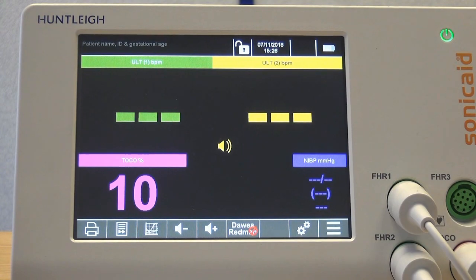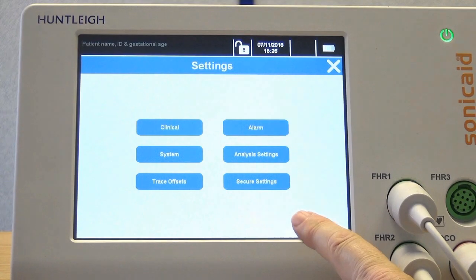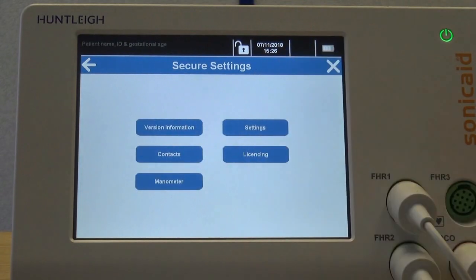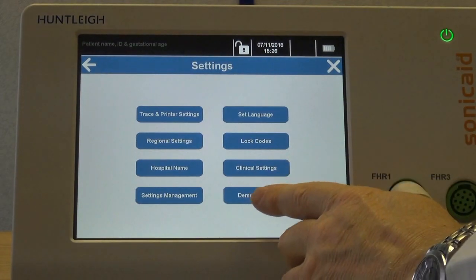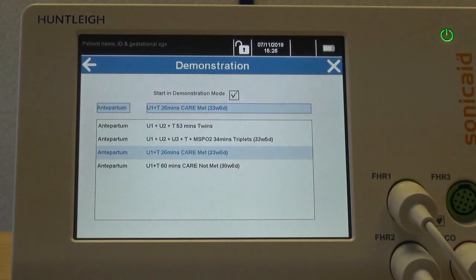To set up demo mode, enter the settings menu by clicking the function button along the bottom. Select secure settings and type in your passcode. To select demonstration mode, click settings and then demonstration. You can select from the trace example shown, select one, then restart the unit.